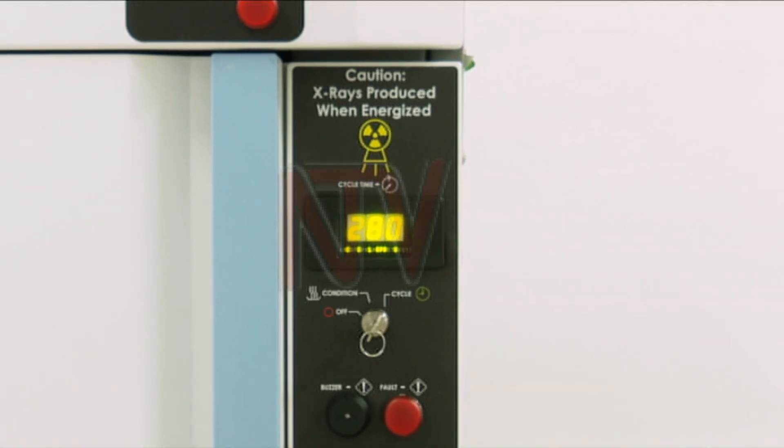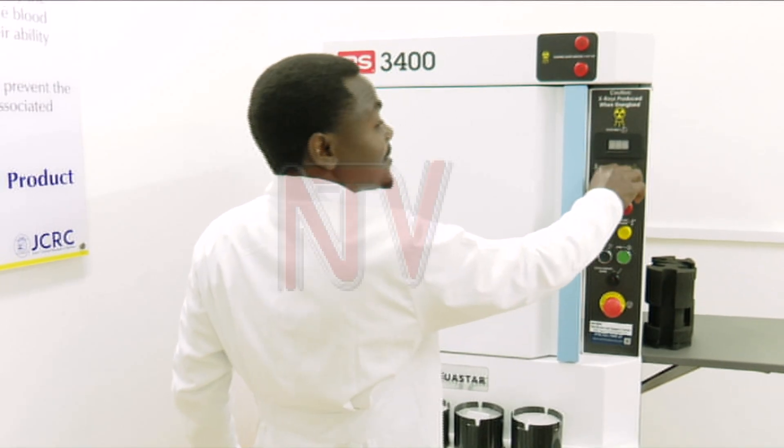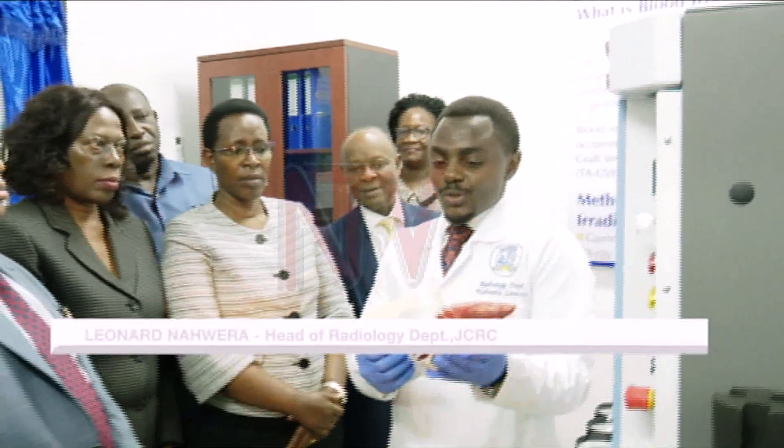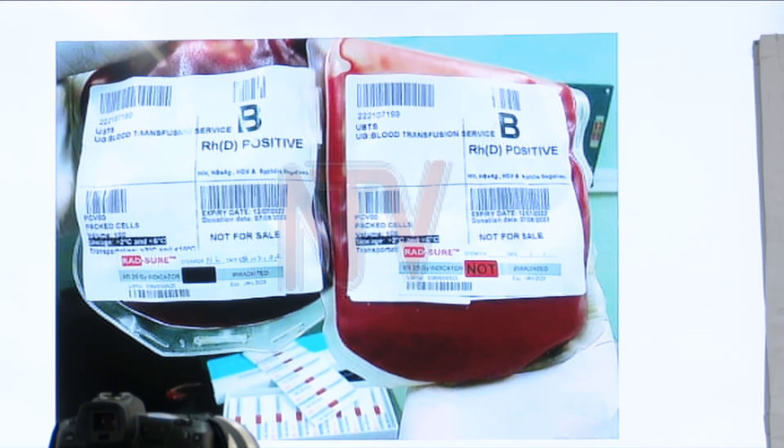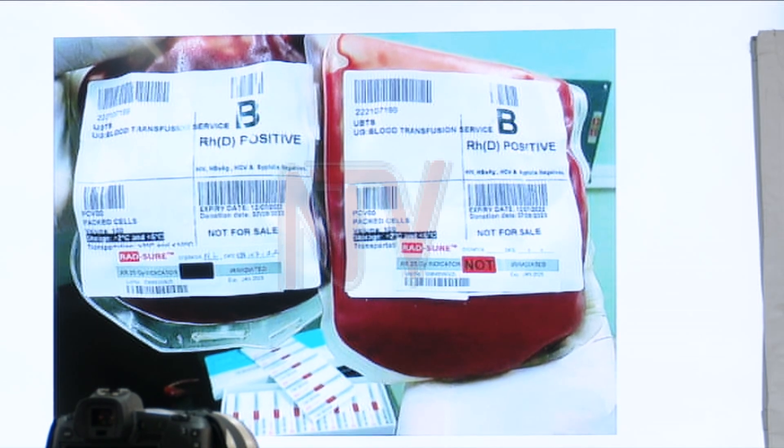How does one tell that the blood product has been fully irradiated? If adequate radiation is not given, this indicator will not change — this knot will not disappear. So this is the visual proof that a product has been successfully irradiated.